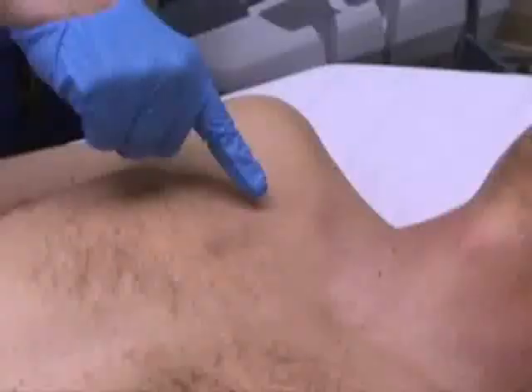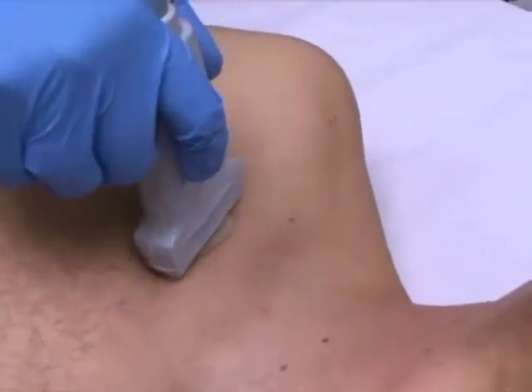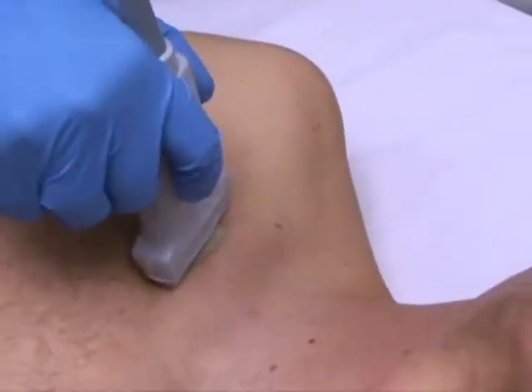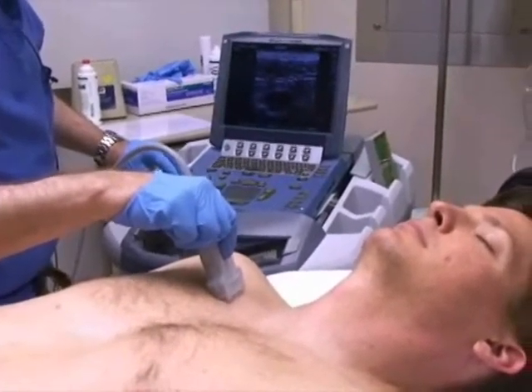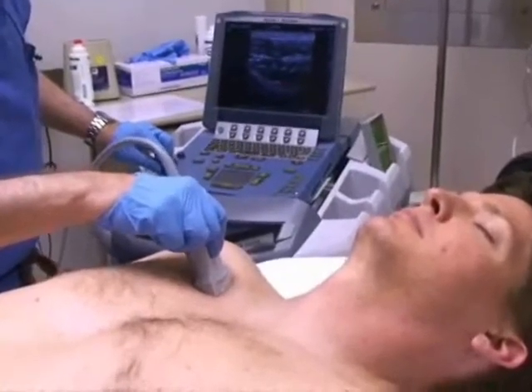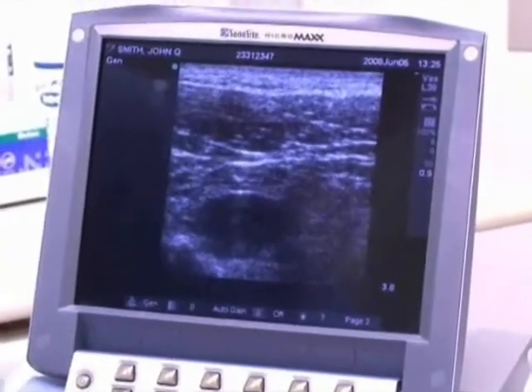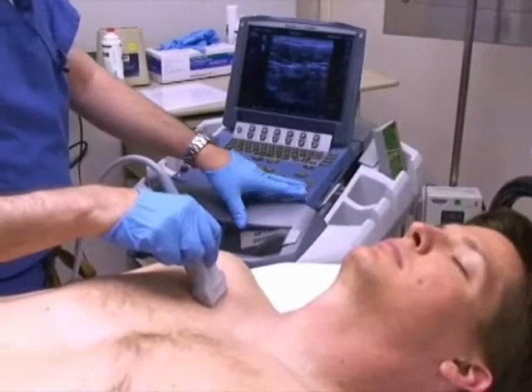Today we'll be starting with a look at the subclavian site. The probe is placed near the site of proposed insertion and the subclavian vein can usually be readily seen. It can be identified by its pulsatility and compressibility. Notice how compressible the vein is in relation to the artery. Doppler can also be used to confirm the location of the vessels.